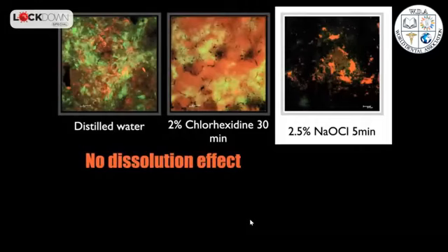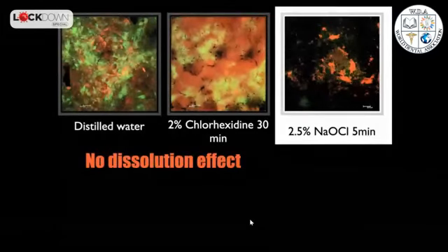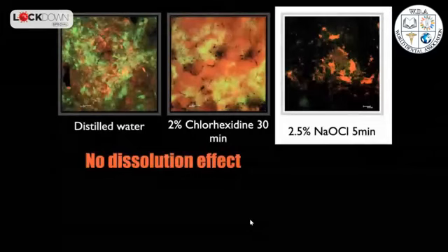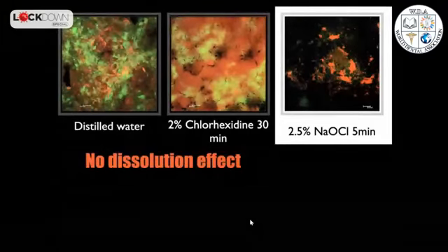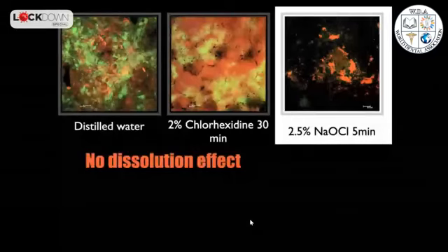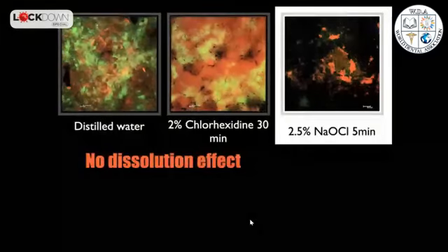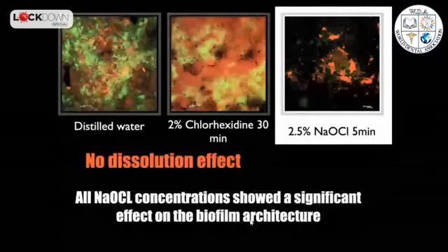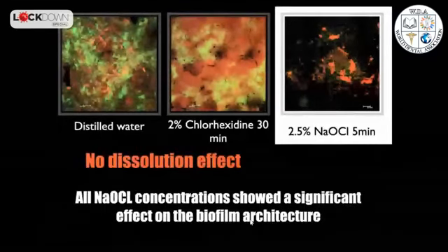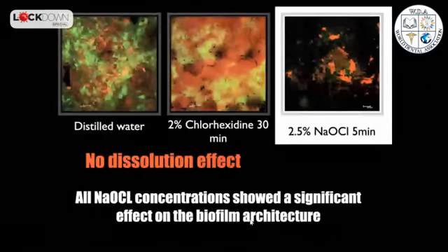And on the other hand, when we use 2.5% sodium hypochlorite, that is a diluted concentration, even for a short period of time, such as 5 minutes, you can see in this picture how the liquid detaches the biofilm from the dentinal surface. So it has a very profound effect on the biofilm architecture. So one of the conclusions that we found in this experiment is that all the sodium hypochlorite concentrations show a significant effect on the biofilm architecture.